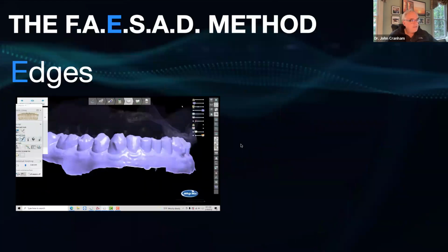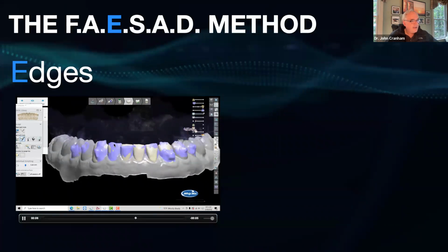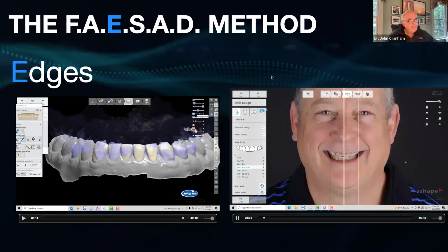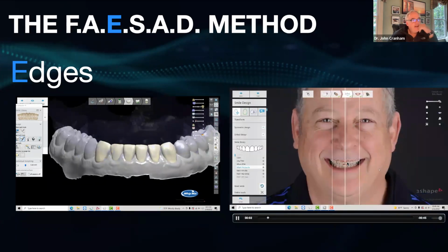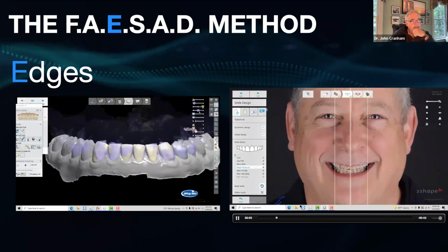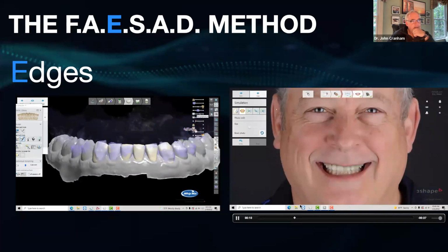And now what really gets fun inside of 3Shape is starting to design your restorations. So I've got the tips of my canines a little bit strange because I'm trying to pick up the mesial of the upper. He's a little bit class 3. So I can kind of look at my lower incisal plane. The blue shows me where his teeth were. The white is where we're going. I can do some imaging to be able to see where I would like the edges to be. And we can even make this porcelain if you'd like to see how this looks.